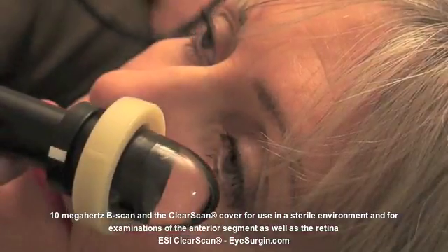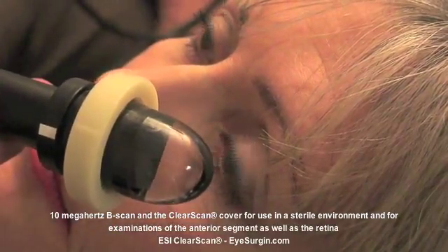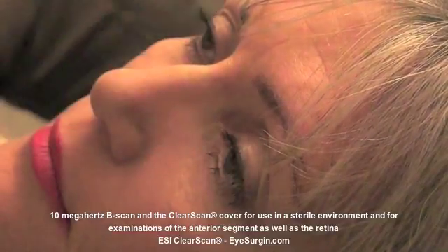ESI, Inc., of Plymouth, Minnesota, manufacturer of the Clear Scan, makes adapters for a wide variety of probes, including the 10 MHz transducer being used in this segment.